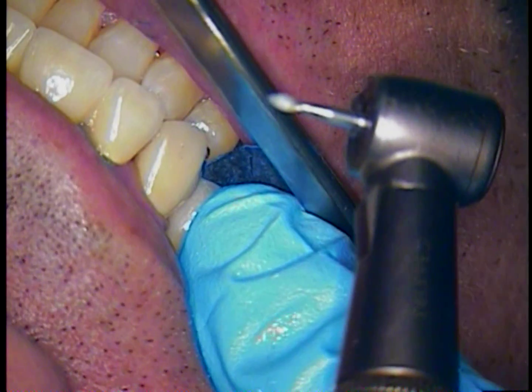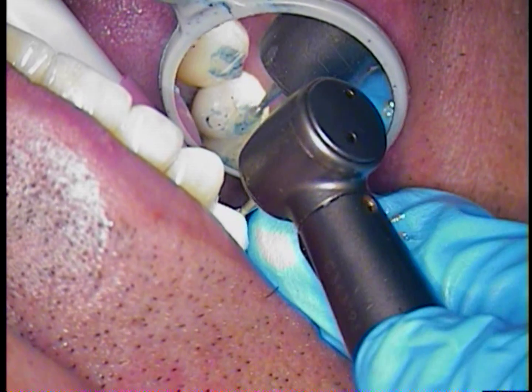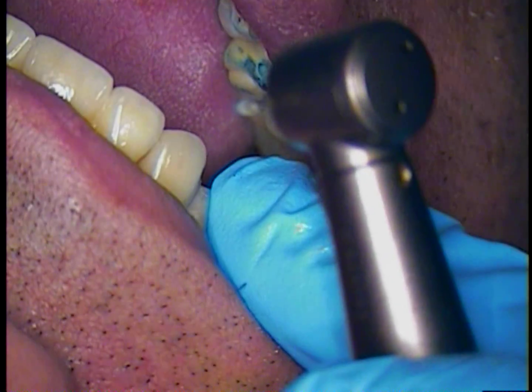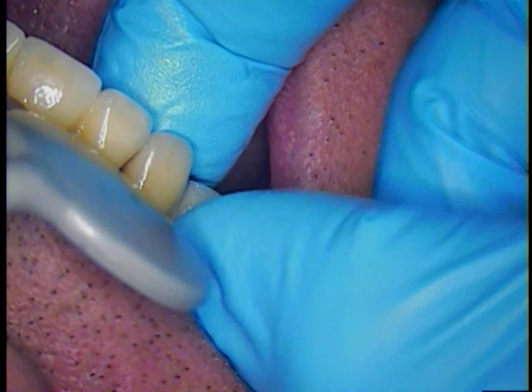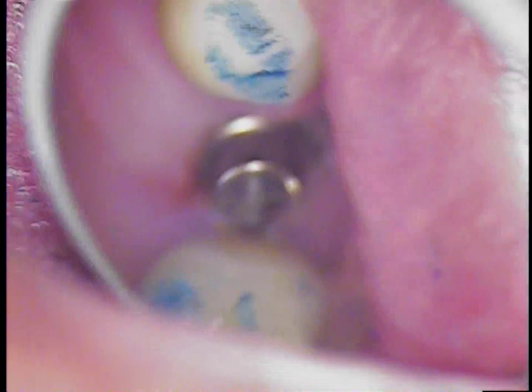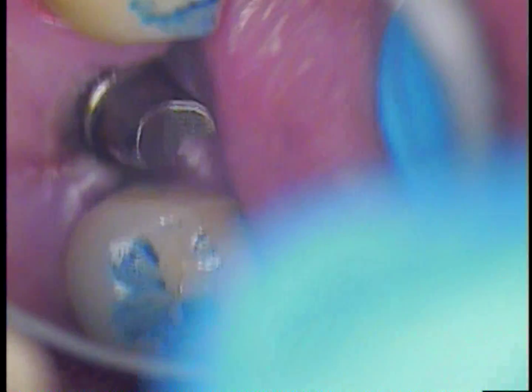Bite down and grind. Still movement, but certainly a lot less. You have to have a lot of patience when you are working with implants. Some of the smallest details can come back two, three years later, and if they are missed — I am not saying anything was missed here — but on every case you have to really pay attention to the smallest of details. Implants don't move; they are embedded into bone, unlike natural teeth that have ligaments that allow for shock absorption.